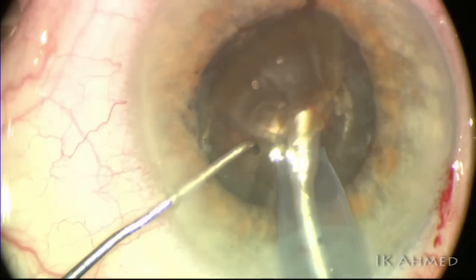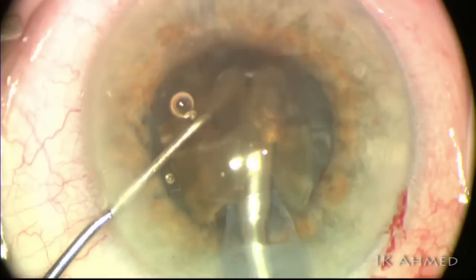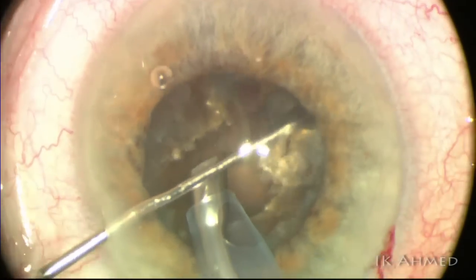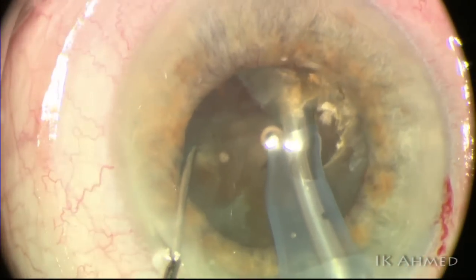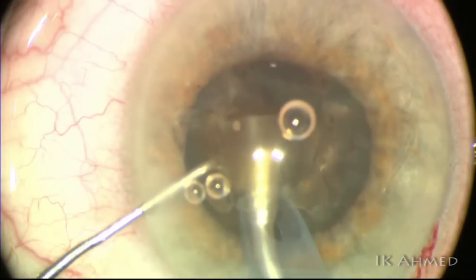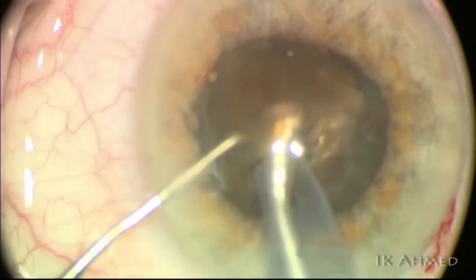We now extract the lens. Notice the blackness — this is an extremely dense lens, not the typical chalky white, but a true black lens. These are often very difficult to get through, and fortunately with this large bore Kelman 30-degree bevel we are able to manage it. This is primarily a vertical chopping technique, with lateral separation to separate and propagate the crack posteriorly. It's important not to excessively laterally separate, due to the risk of capsular-zonular trauma, particularly when significant nucleus remains in the capsular bag.